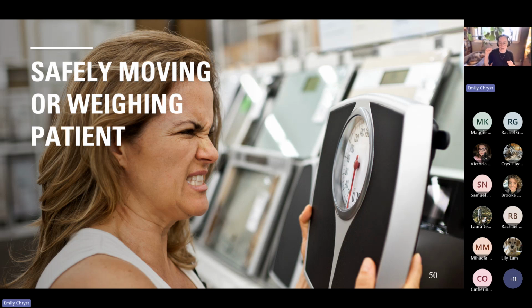I make sure that I have an ambu bag with mobile oxygen tanks if I have to move the patient. And then the final thing that we're doing after we disconnect everything else is disconnecting them from the ventilator. That should be the very last thing. I will always have a mobile pulse ox with me so that as I'm moving the patient, I have some way of continuing to monitor them, but I'm going to be breathing for them with an ambu bag. An EtCO2 capnograph can be really helpful here too. But this applies to anything.